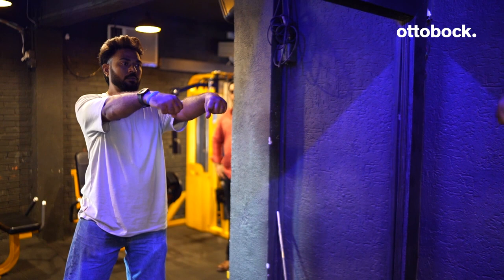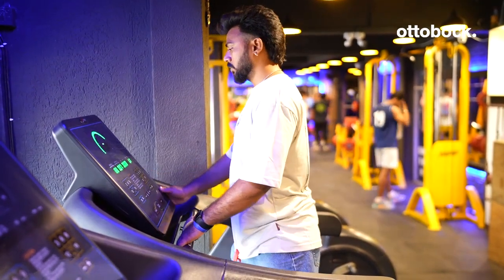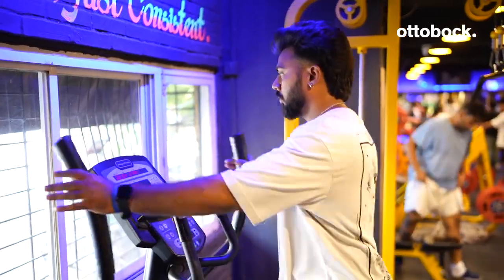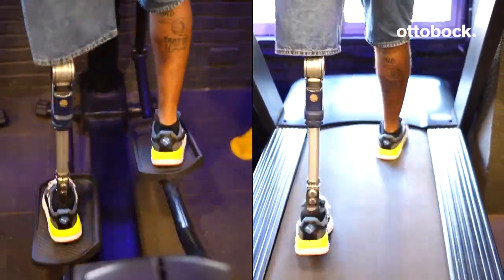I always start my workout with some cardio to warm up. I walk or run on the treadmill, use the stationary bicycle and elliptical. My prosthetics support me to do all of these with ease.